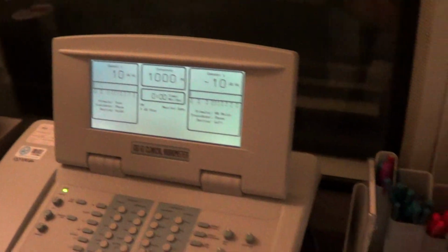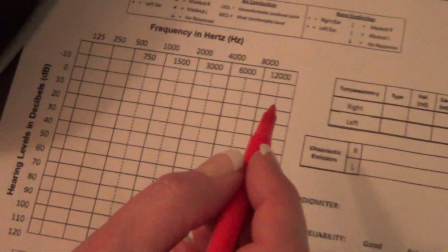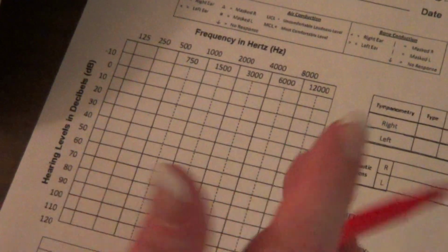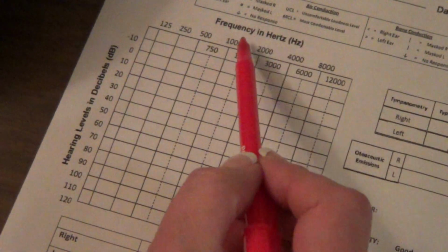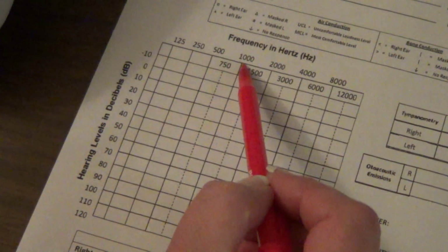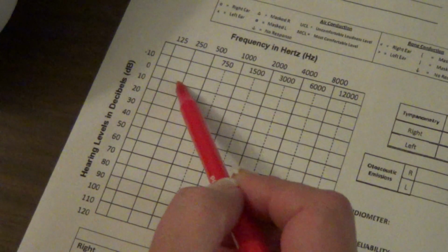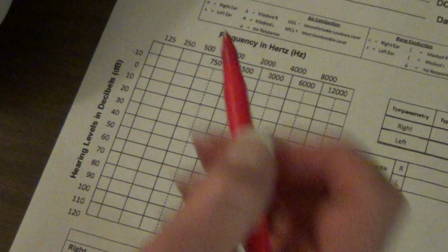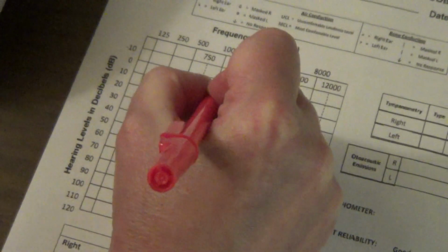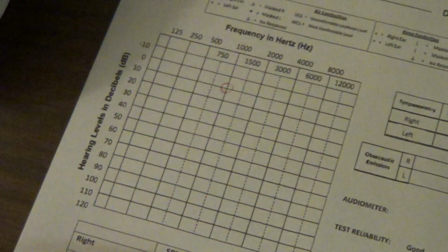So now what I'm going to need to do is grab my red pen, because it's red, right, round, and I'm going to actually mark it on the audiogram. So I will look across the top to 1000 hertz, look over to the side, find 10 decibels, line them up, and here is where I will put my mark. Okay.